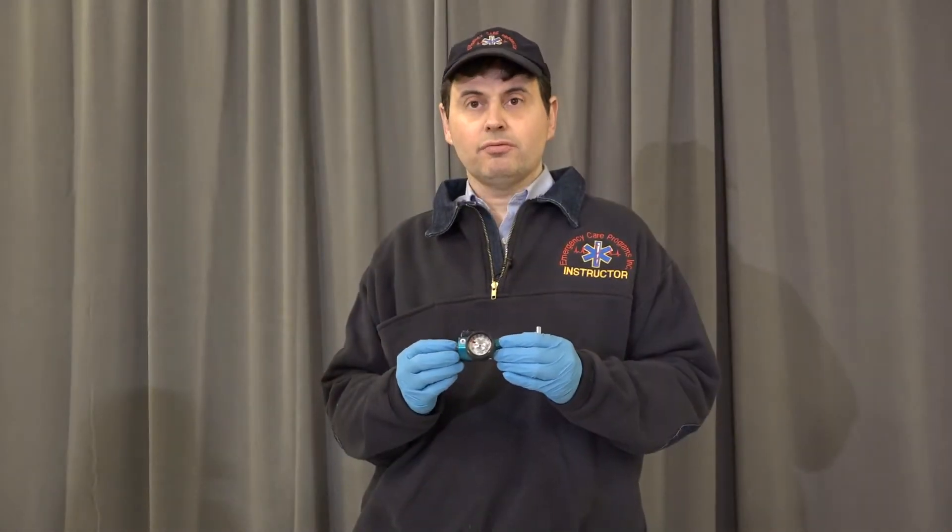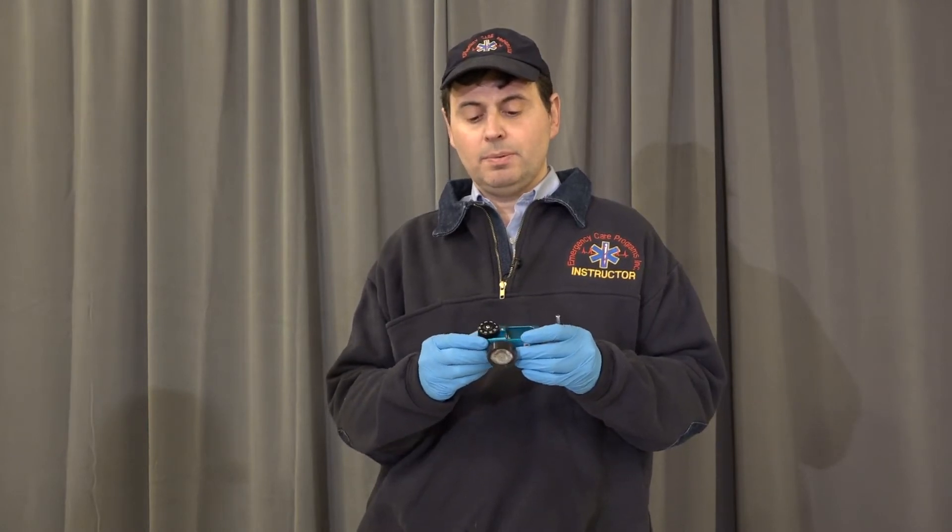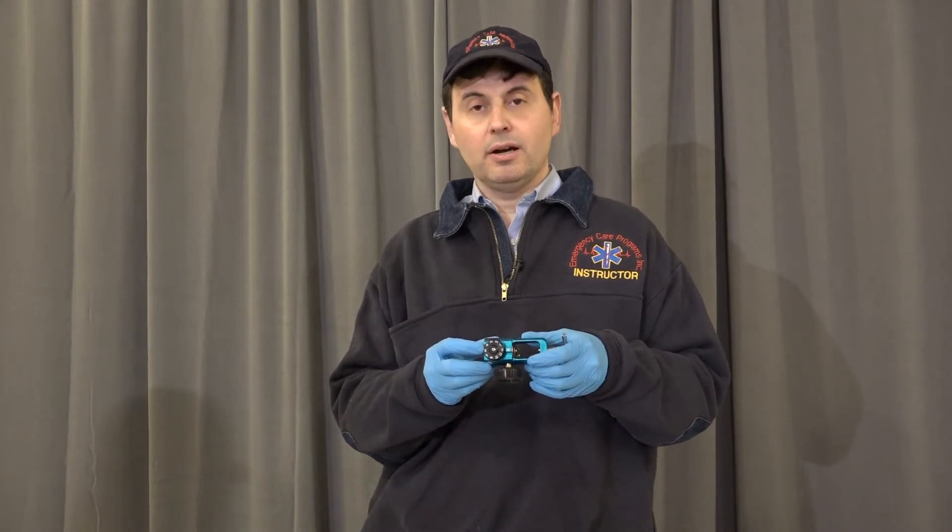This is the oxygen regulator that we're going to place onto the oxygen tank. The regulator is going to reduce the pressure to make it safe to deliver the oxygen to the patient. The parts of the regulator: we have the pressure gauge, which is going to read the pressure contents within the tank, and we also have the flow meter, which we're going to adjust to the desired liter flow to deliver the oxygen to the patient through the appropriate device.